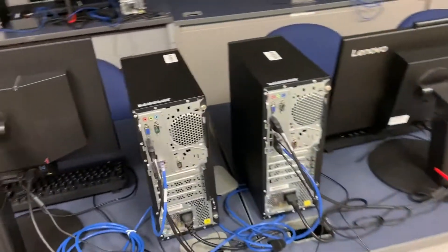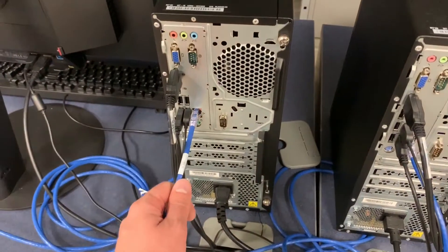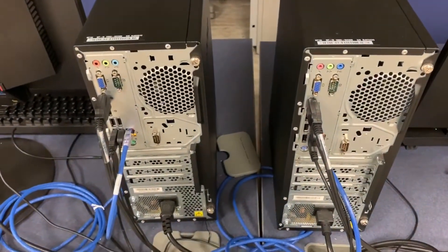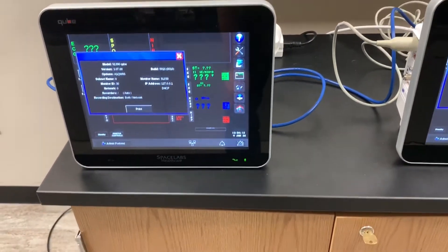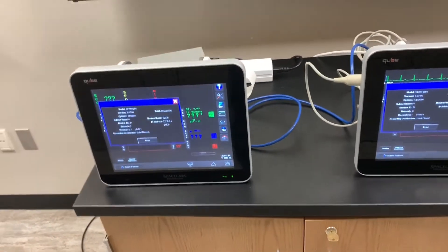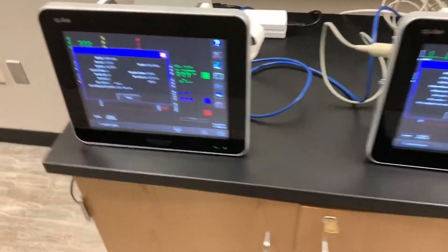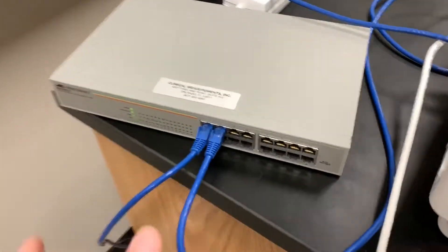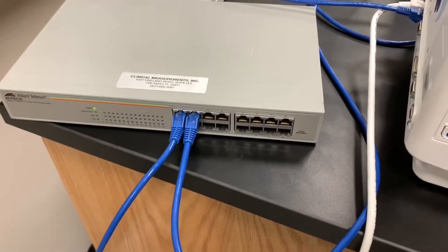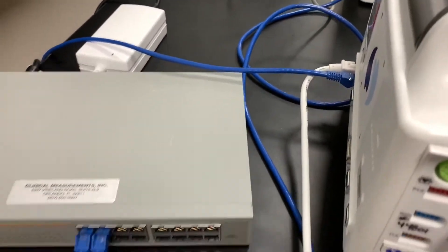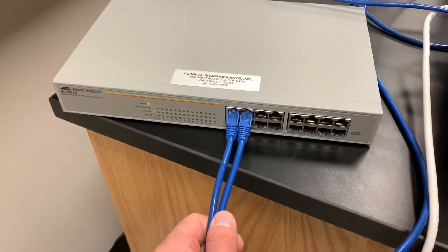Unlike with normal computers, where you could take a single Ethernet cable and plug it into both computers and network them directly, these devices are not capable of doing that. They don't have what's called AutoMDIX, which allows them to reconfigure their ports so that you can use a direct link between one and the other. They don't have that feature, so unfortunately you have to use a switch. The alternative would be to use a crossover cable, but I went ahead and just went with a switch.